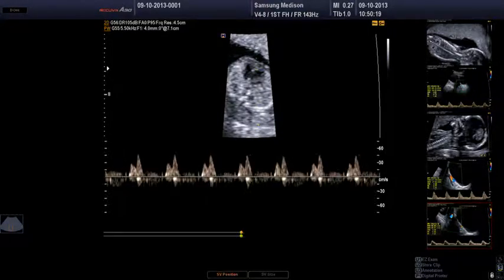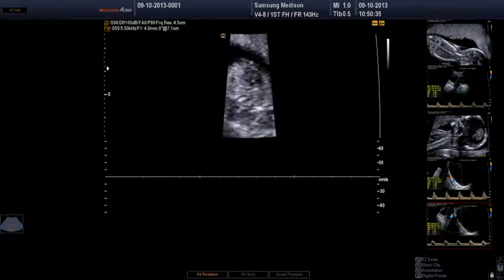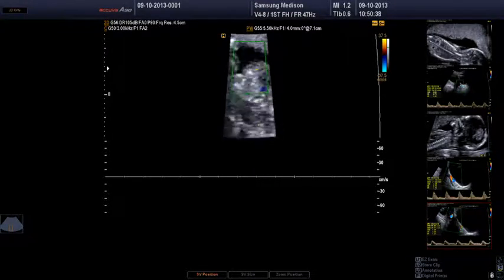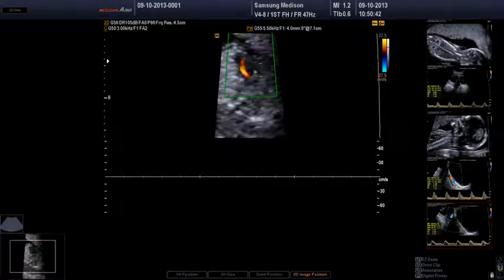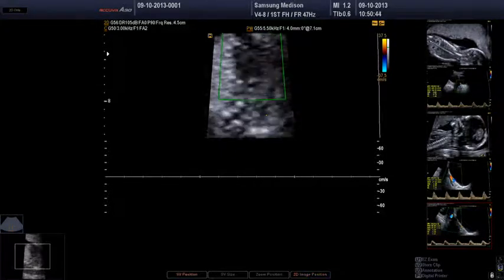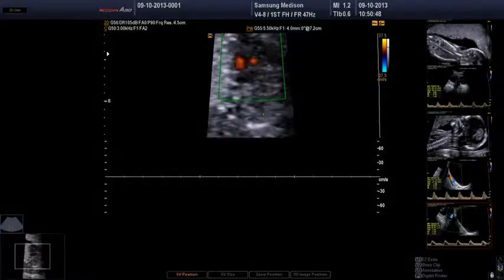Yeah, just freeze it. So you can see that's the EA wave that you get with inflow through the tricuspid valve going up the screen. And we haven't seen any significant regurgitation there. Let's just take that off again. Just go back and perhaps just put colour on. Have you moved your cutoff to 60, or are you still using 80 as a cutoff to consider tricuspid regurgitation? I would tend to sit between those two figures, actually. I usually use about 75.